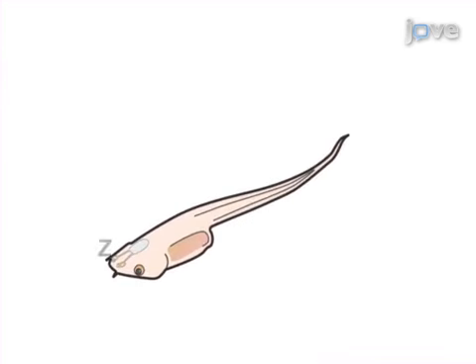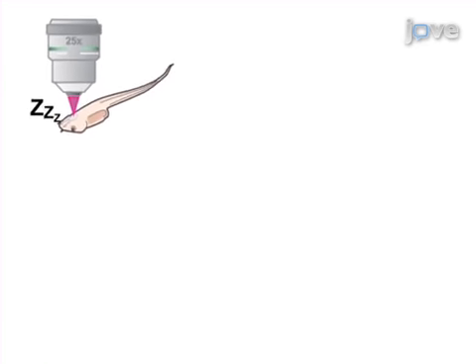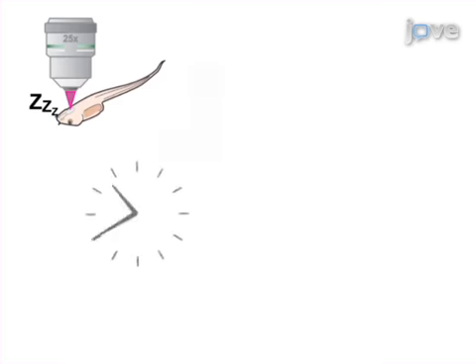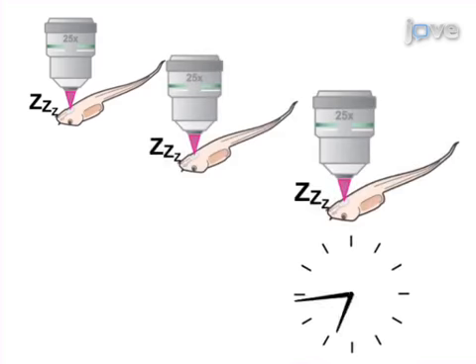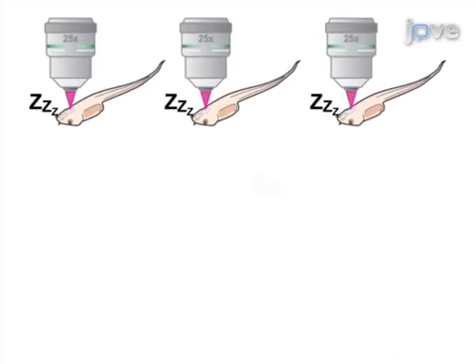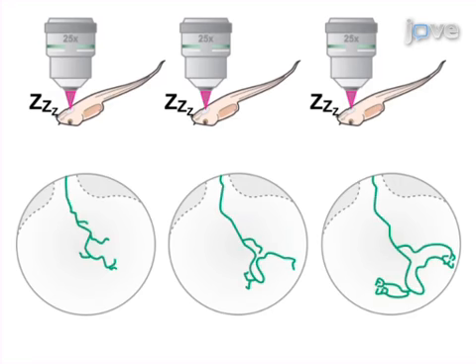Next, a tadpole is anesthetized and a three-dimensional image stack of the olfactory bulb is acquired using multiphoton microscopy. The final step is to repeatedly examine the labeled neuron in the same animal after specified time intervals. Ultimately, reconstruction of cellular morphology allows the visualization of changes in axonal morphology.